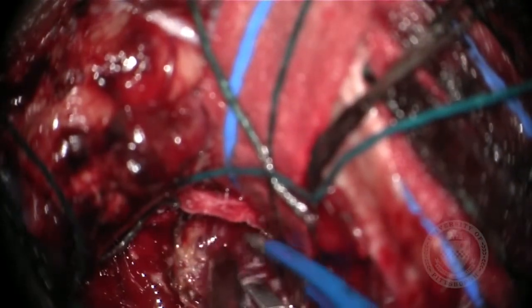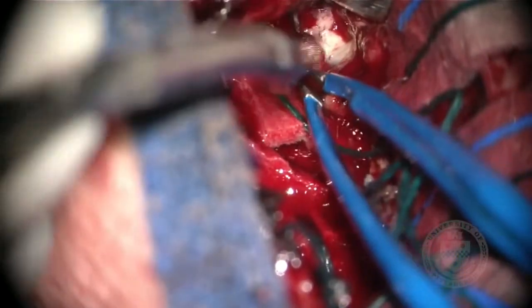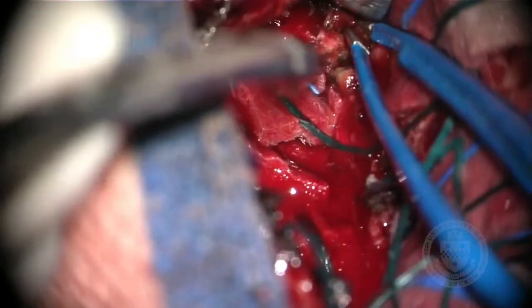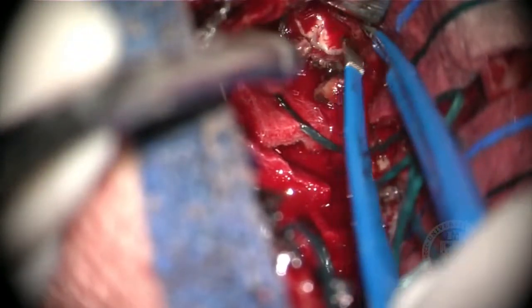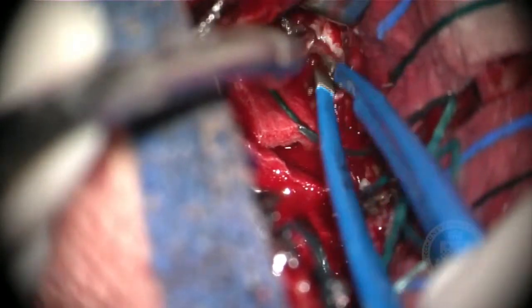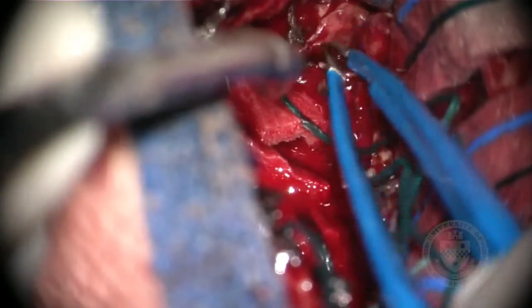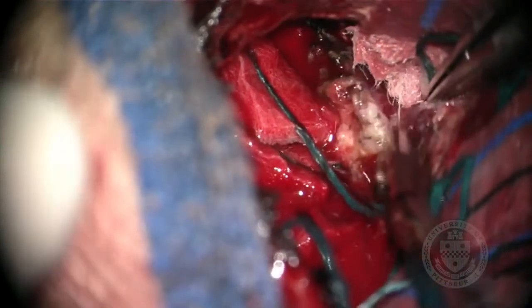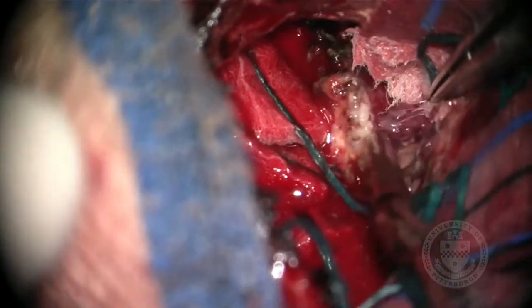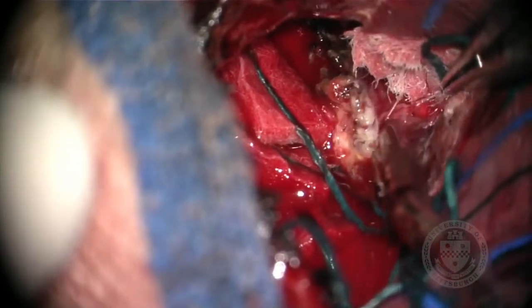Our goal is to continue debulking the tumor until we can find the choroidal fissure. Here we can see where the choroid plexus is located. We try to work again on the tumor side of the choroidal plexus, or the hippocampal side of the choroidal plexus. And here we start finding our choroidal fissure.